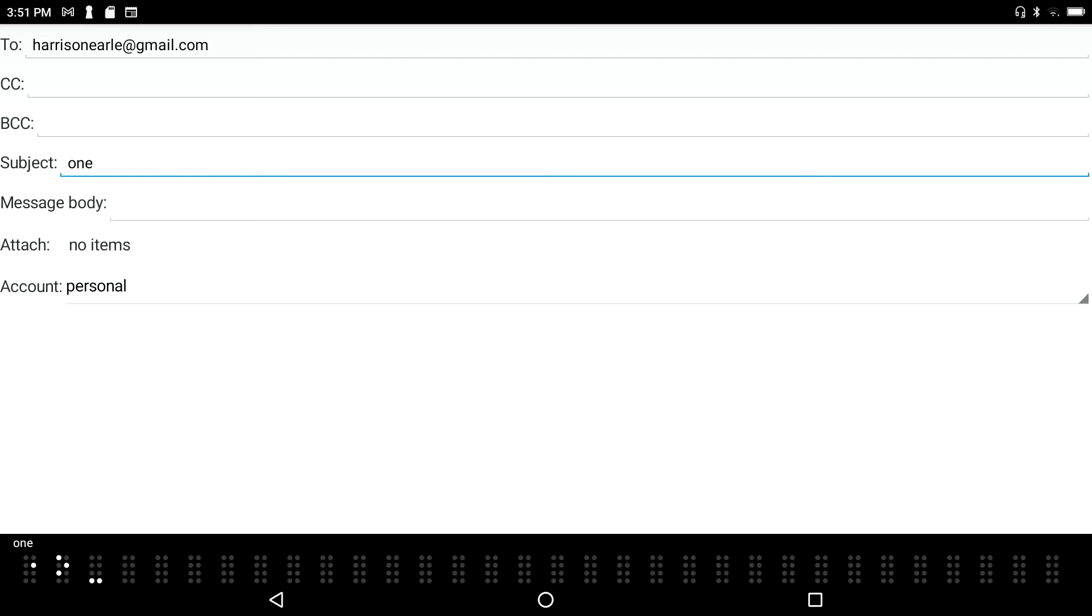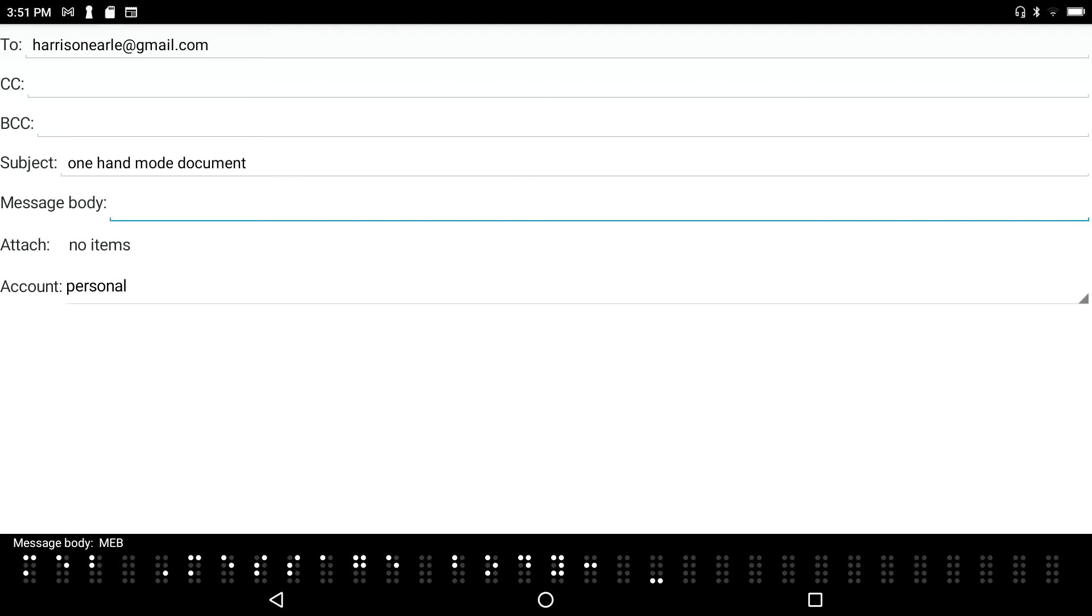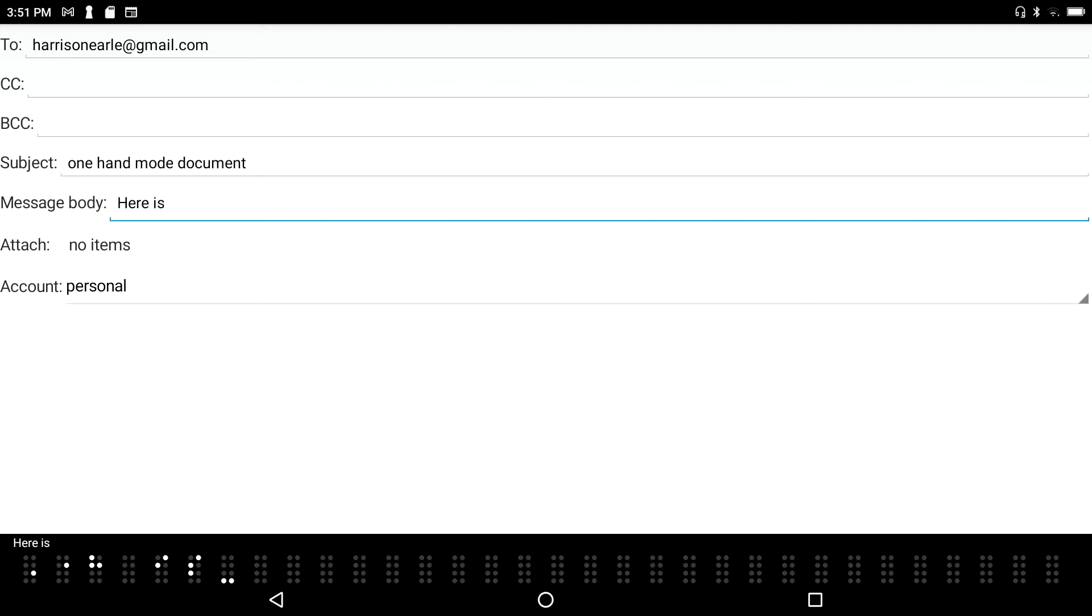One hand mode document. Message body multi-line edit box. Okay. And I can just type in here. Here is the oops, here is the document.